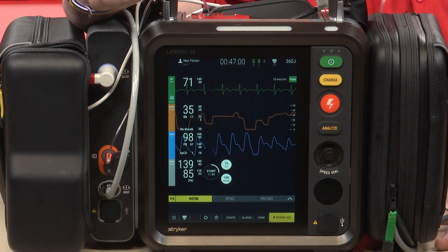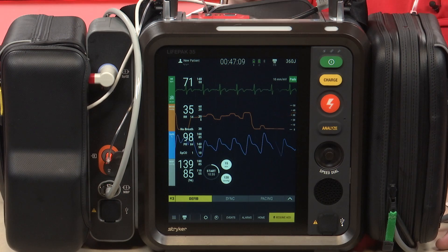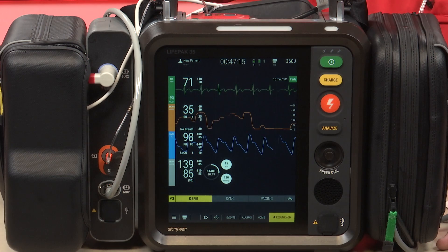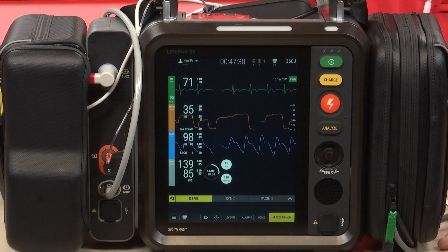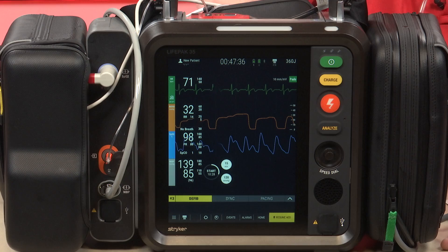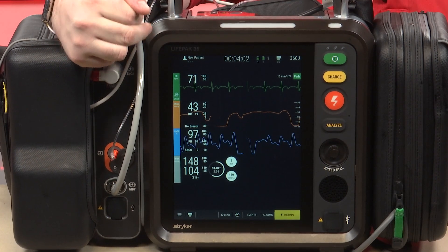One of the other things that's new with the LifePak 35 is the trending and patterns feature. This is really helpful especially for critical patients — trending blood pressures, pulse ox, and so on — especially when reporting to the nurse or physician at the hospital about where the patient was initially and how their condition improved or deteriorated over the course of care. Before, we had to press code summary and look at the trend ourselves, but now the LifePak 35 actually graphs that for us.